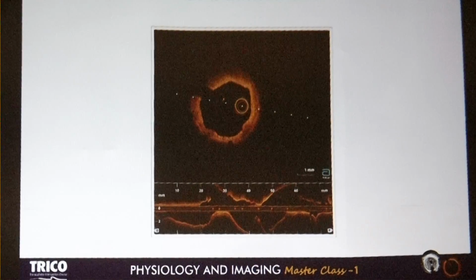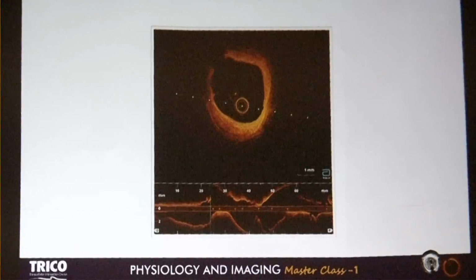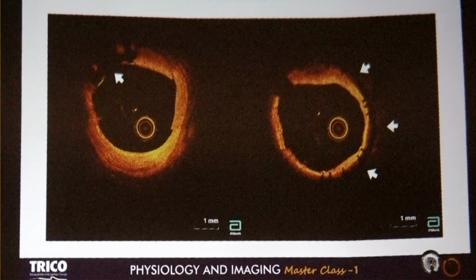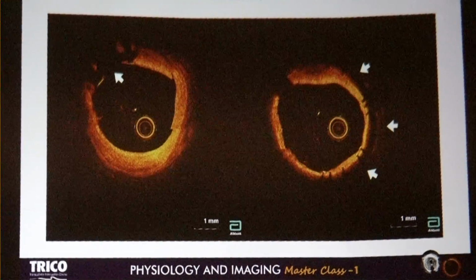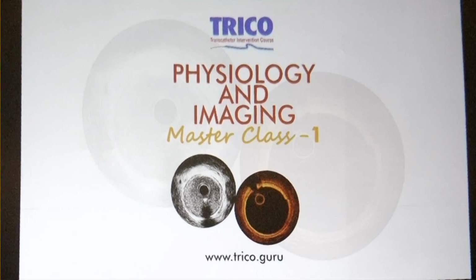and you can see this is the excluded part, and here there was a rent, the area which was open through which the blood was pouring in, and we are awaiting the check angiogram of this patient, maybe in 2 or 3 months' time. So this was what I wanted to show. Now I want to keep the session open for any further discussion or any question or any query you guys have.